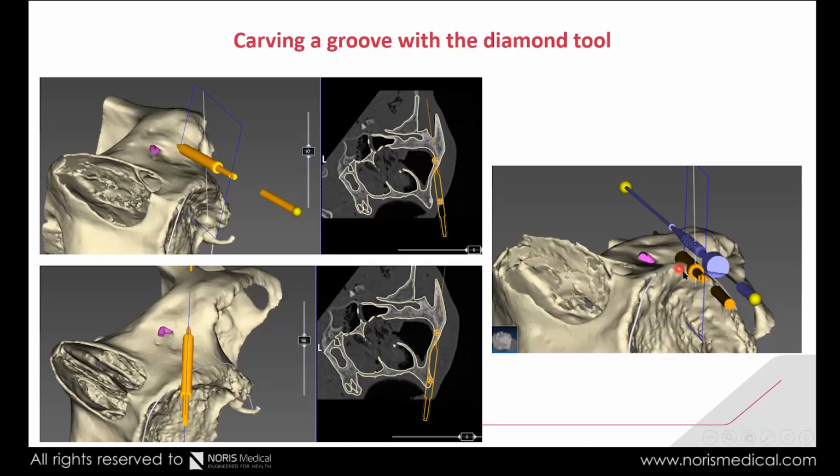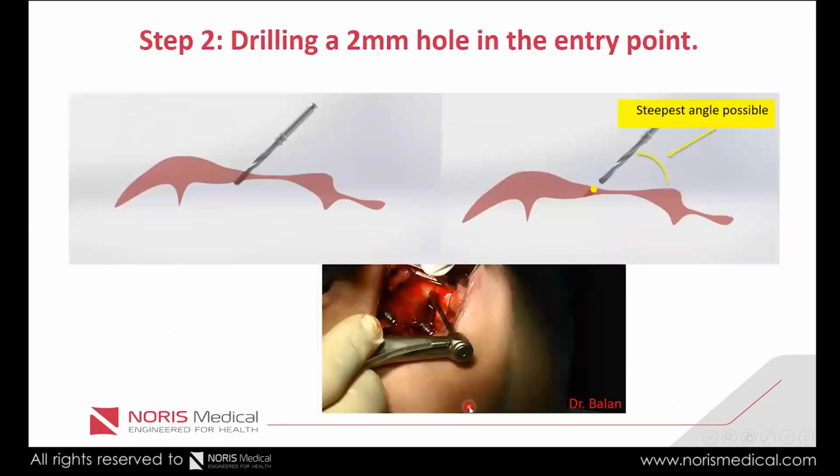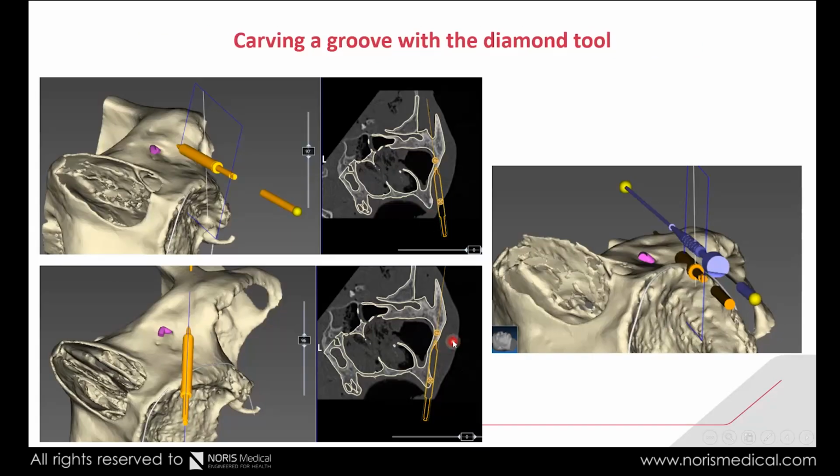We see the diamond going down. Okay, I forgot to continue with the slides. So this is the pencil line, an isometric view of the pencil line, and now we guessed this one to be the entering point, and we move down like that. We move down to this position. We started from this position, and what happened here? Let's see. Yeah, we started from this position, and we're going down to this position.